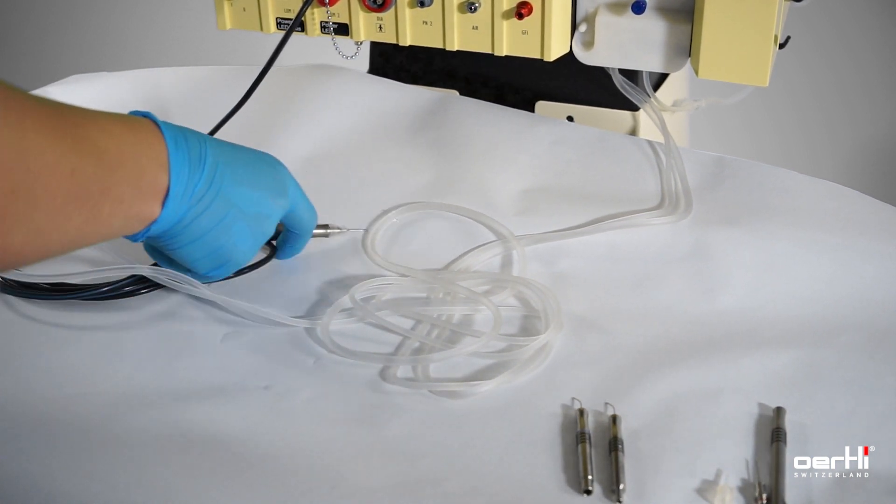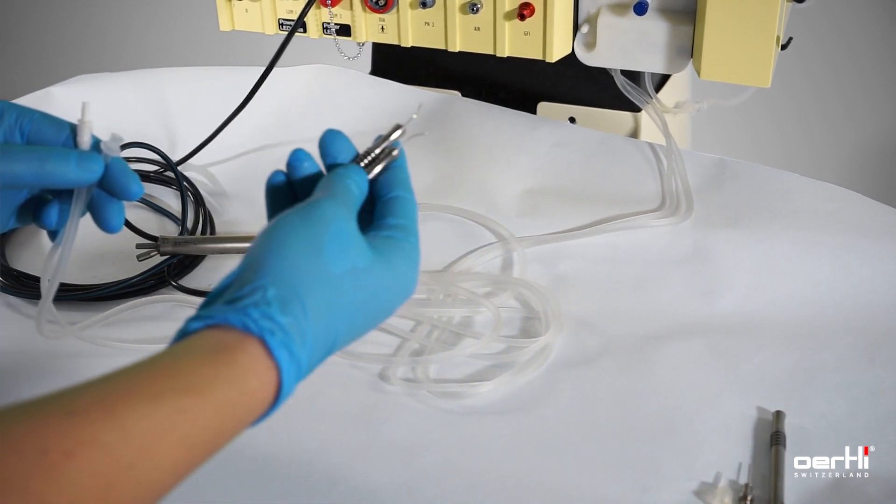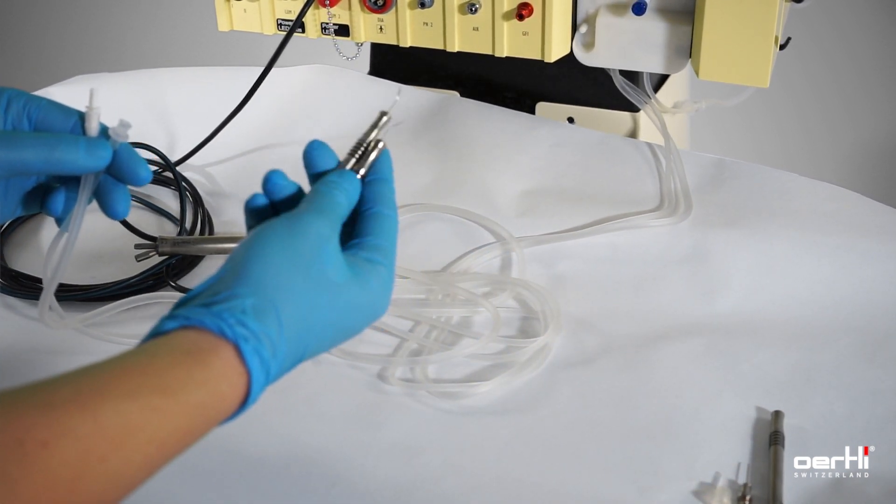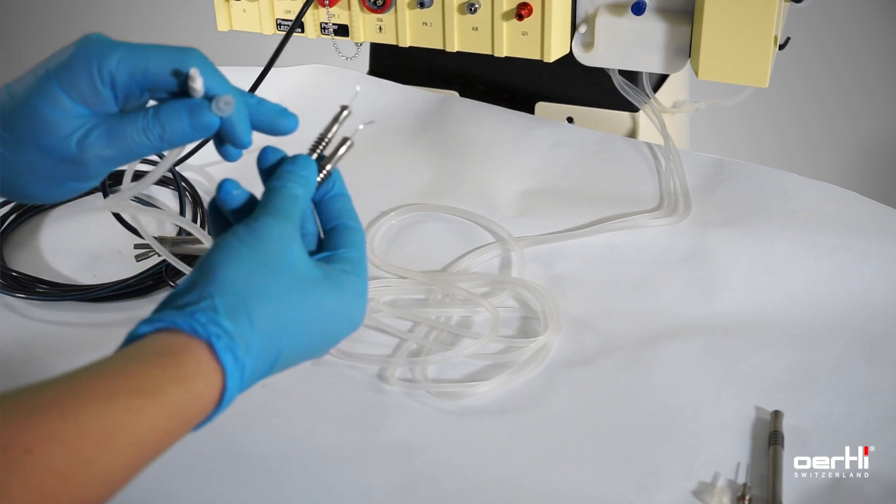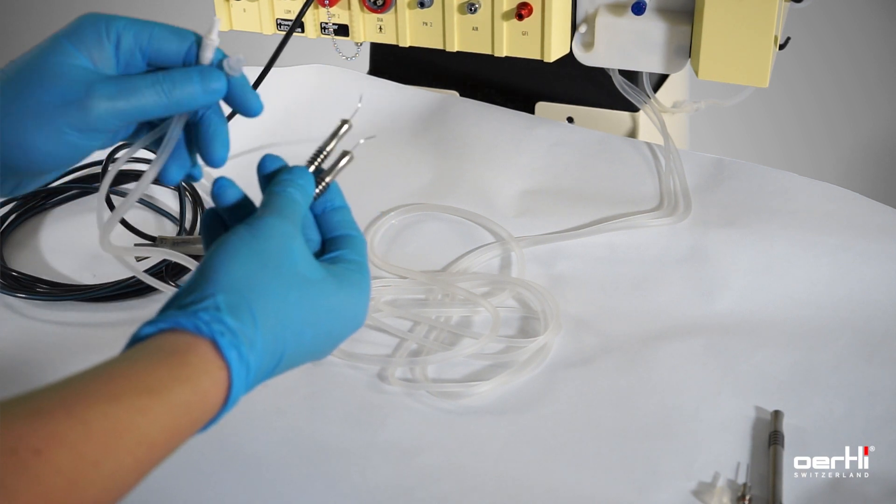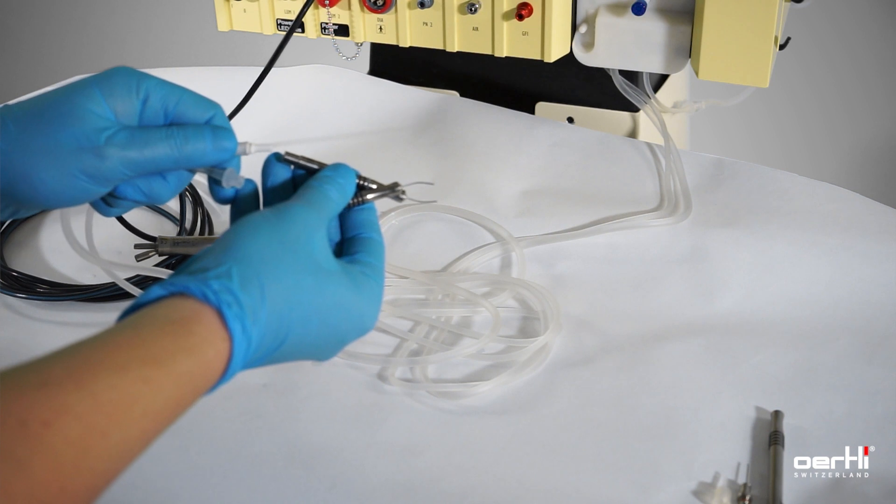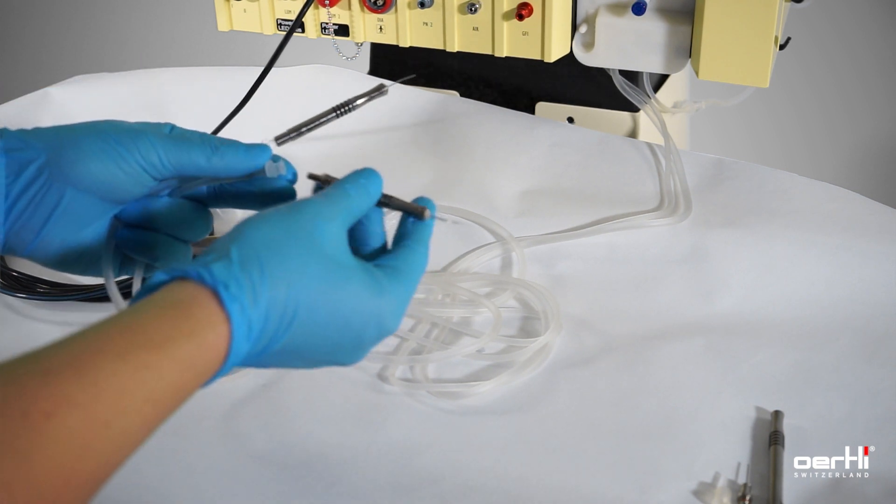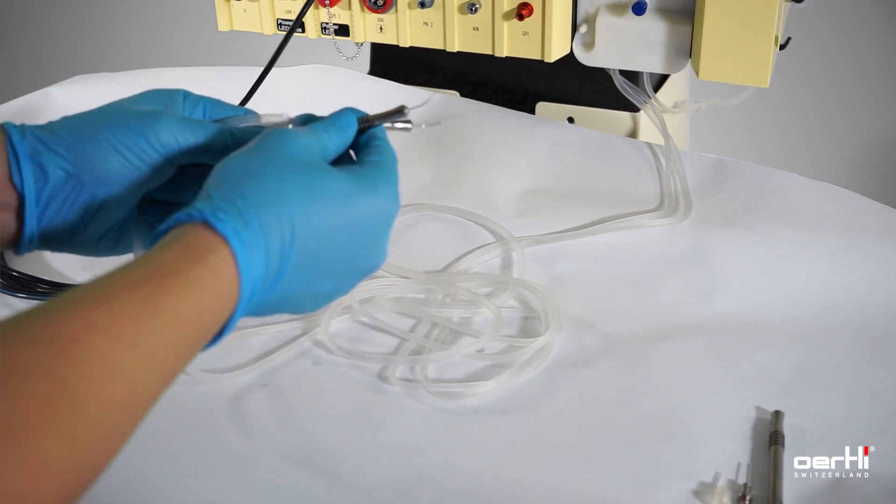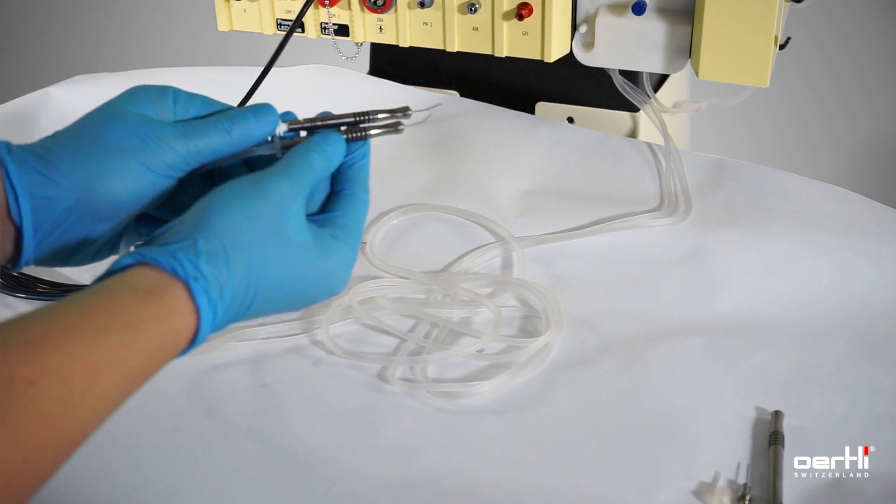Then either you use the bi-manual reusable handpiece or single use. The green part indicates the irrigation, so you attach the irrigation tube and on the other hand side the aspiration tube, like this.